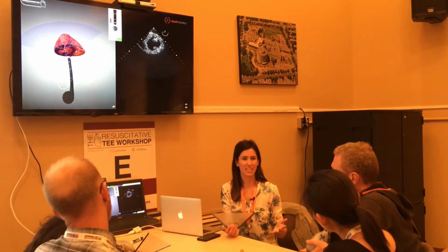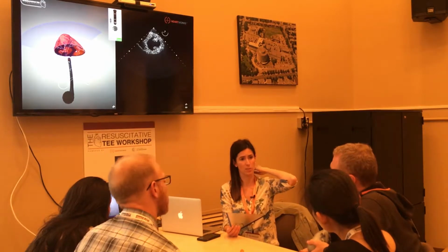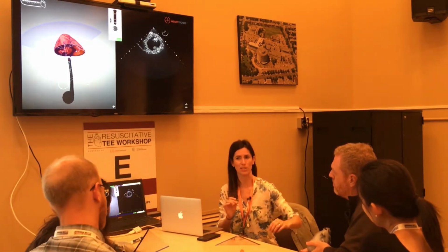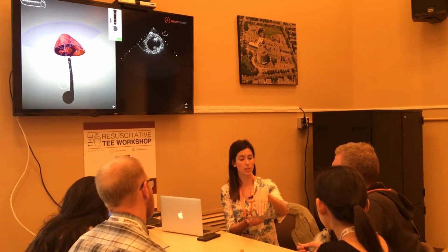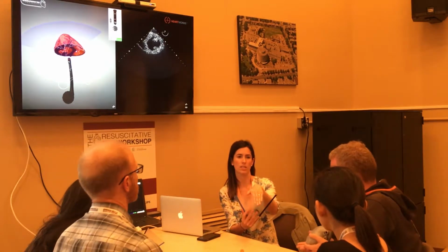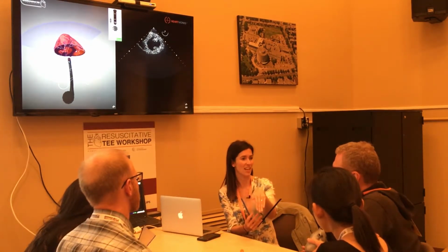The problem, though, is that what kind of things are in the stomach? Air, food, stuff. Air causes us the most problems, and especially if this is a person that's been bagging at a certain point and there is some air in the stomach. You can get washout. So on these simulator machines, you just thread it down. Oh, it's beautiful, right? On a patient, you may need to do a little bit of anteflexion, okay? That's because you want to make contact with that anterior stomach wall there, so that you displace any air that could have collected in that area.